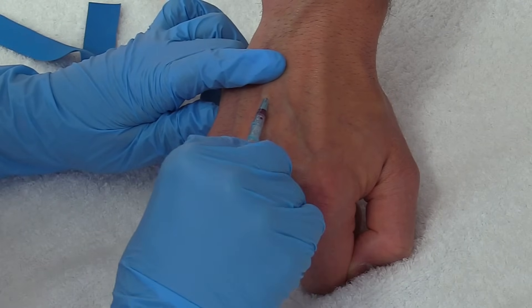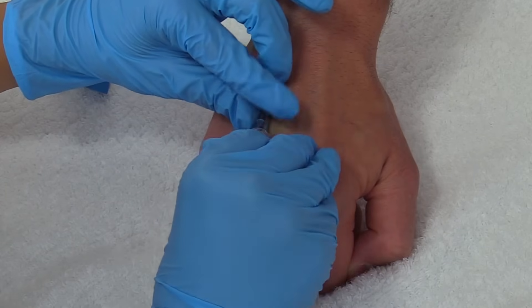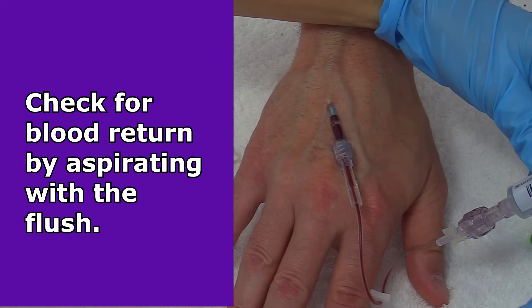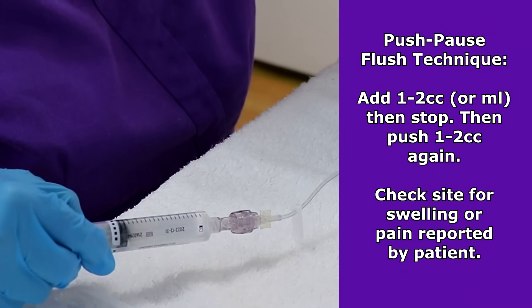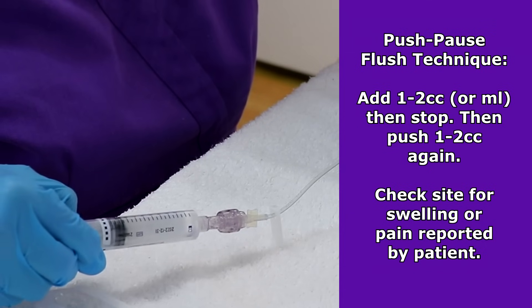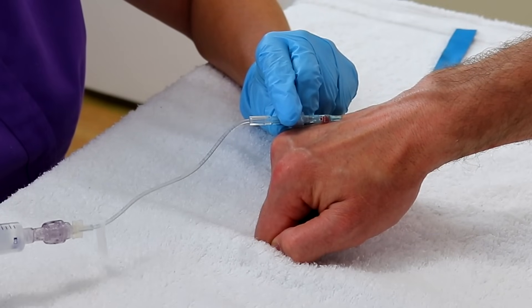I want to connect this and then twist it on, making sure it is nice and secure because you don't want it to get loose. First I'm going to check for blood return — and we have it. Then I'm going to flush the IV using a push-pause flush of about three to five cc's — one to two cc's, pause, flush again one to two. I'm looking at the site; it's not bubbling up, which would indicate infiltration. And how does the site feel to you? Feels fine, doesn't hurt. And it looks great.